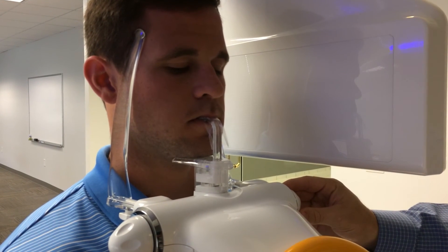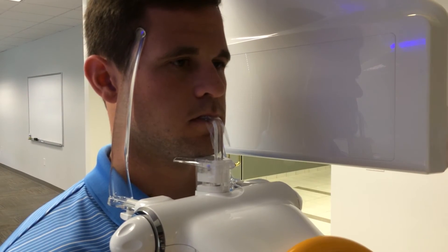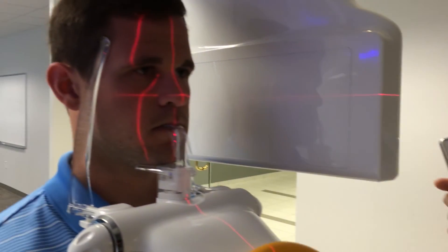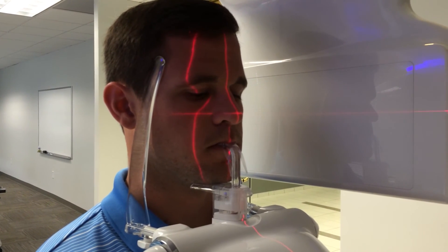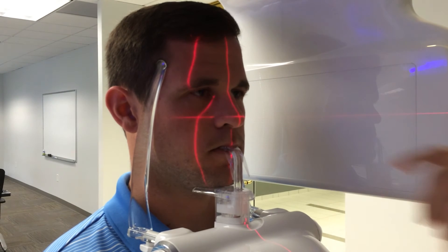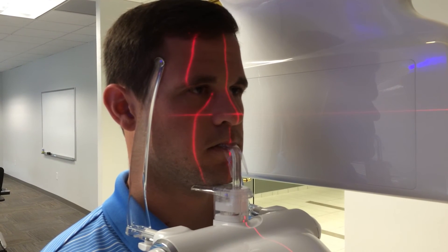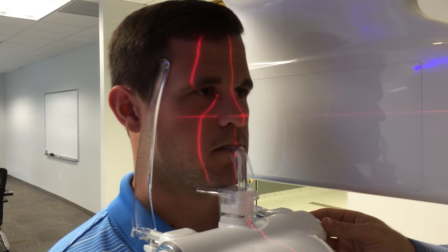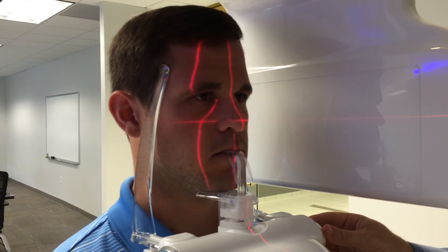With the patient in the machine, the positioning lasers are turned on via the remote or touchscreen. There are three lasers to pay attention to. The first is the mid-sagittal plane laser, running vertically down the middle of the patient's face — when the temple supports are closed in, this laser often falls into place naturally.